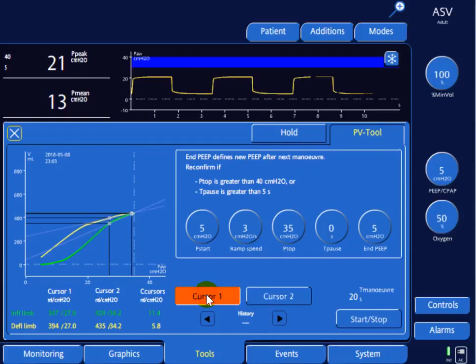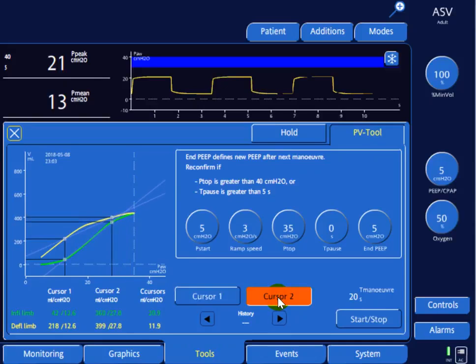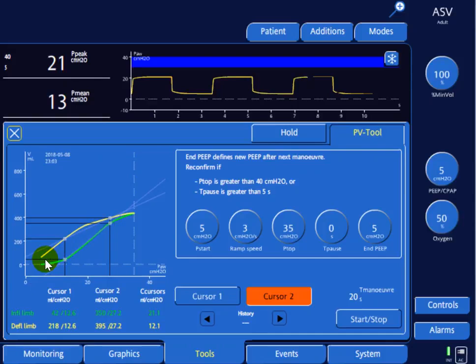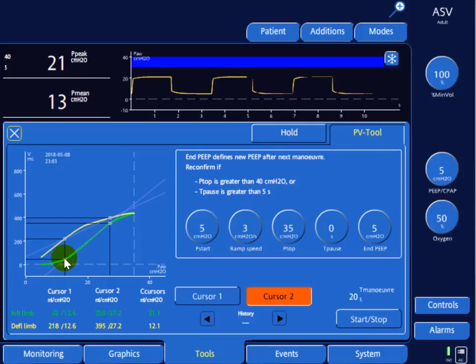Placing the cursors between the lower and upper inflection points, we can see that ventilating the patient in this range gives the best compliance. If pressure drops below the lower inflection point, alveoli will collapse and de-recruit. Therefore, we set PEEP at 2 cmH2O above the lower inflection point — meaning PEEP should be set at 14 or 15 for this patient.